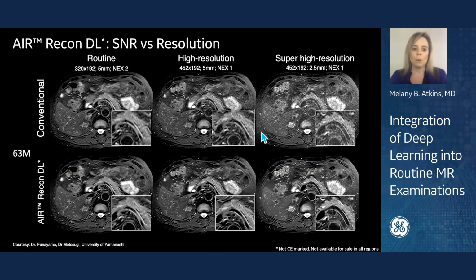And so for the remainder, I would like to go over a few examples and cases of how we utilize deep learning reconstruction and how we plan to use it in the future as well. So you can utilize deep learning reconstruction to increase your resolution.